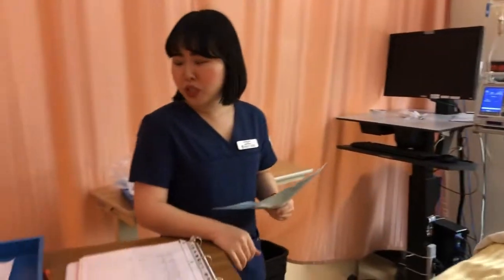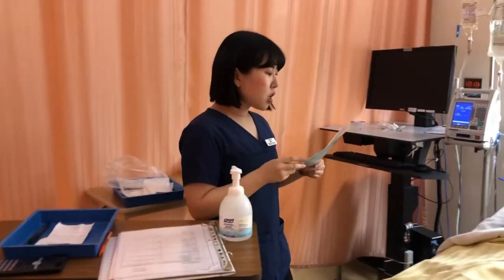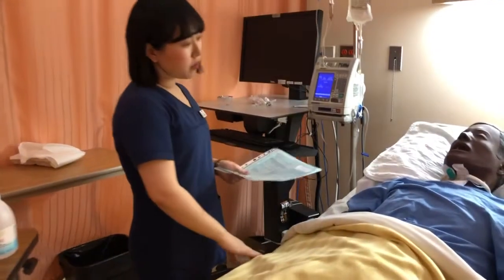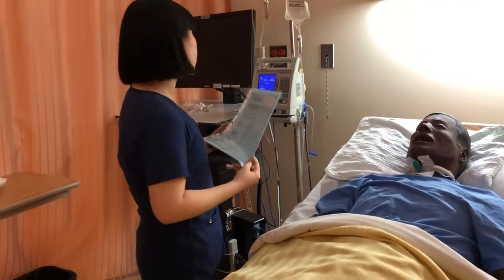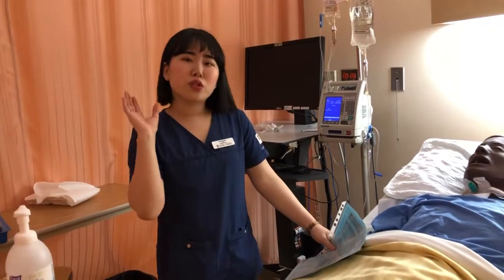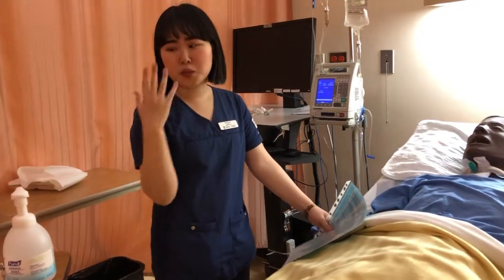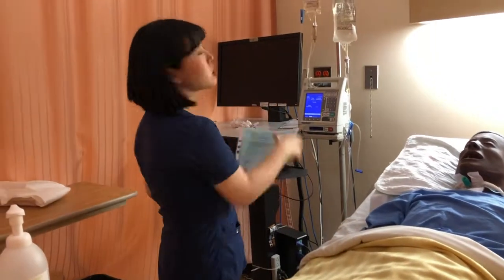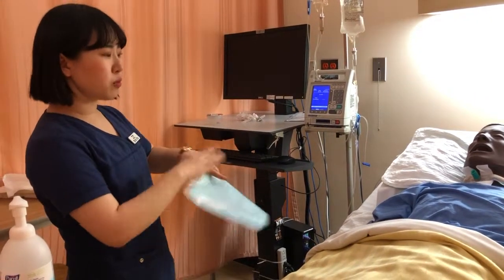So, hi, Mr. Scotland. I'm going to be your student nurse today. So I'm going to be administering the insulin. My previous nurse already checked, prepped the medication and primed the tubing, and the medication is hanging on the bedside. So as soon as I enter the patient room, I do the safety check.